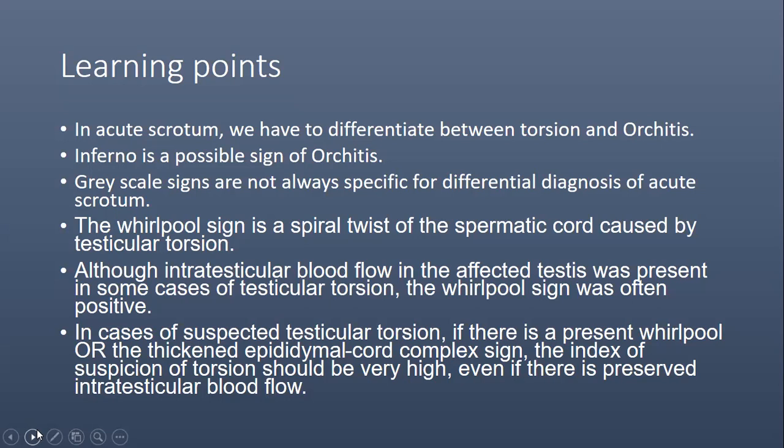So it's important that we look at some of these things. Also, if you have normal preserved blood flow, it does not exclude torsion. You need to look at other parameters so that you don't miss the diagnosis of a torsion, because this is an emergency case.